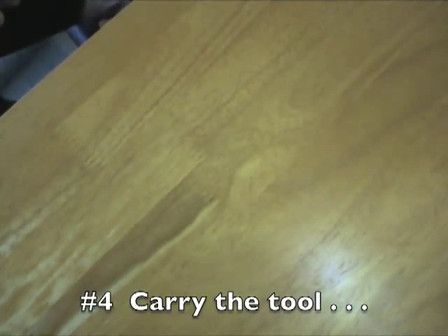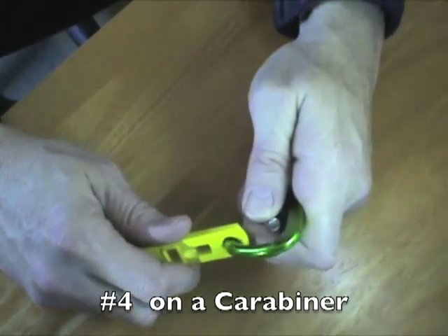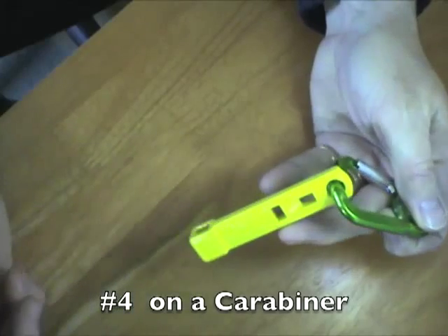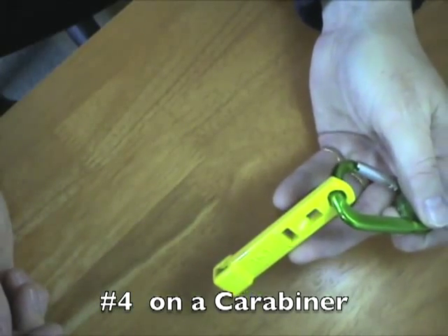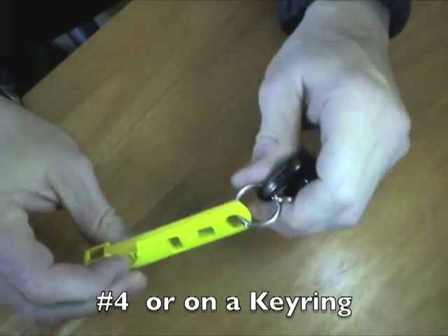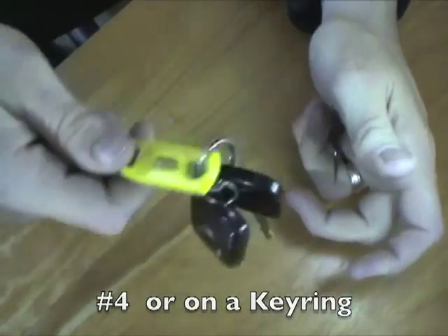Finally, reason number four: carry the tool how you want. It fits easily on a carabiner — snaps right on there, easy to carry with you, attached to your gear, your bag, or your belt. You can also easily attach it to a key ring and slot it right into your belt to keep your keys with you. The bottom line is you're not going to lose this tool.